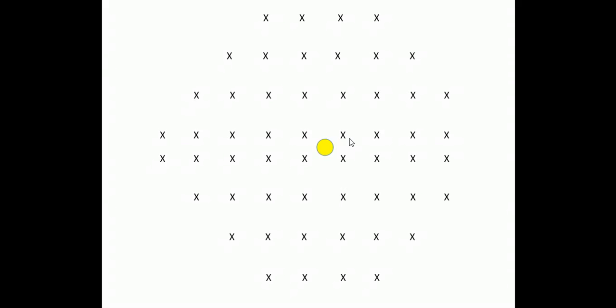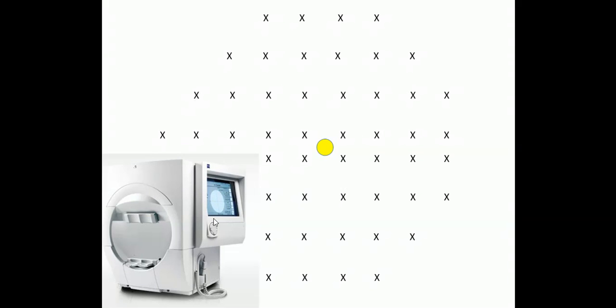So the machine is built in a clever way. First of all, there's a screen over here, and we can't see it here, but this light has a camera associated with it that's taking a picture of the patient's eye. The technician running the test can actually see the eye. It's a live video, and if the patient's looking around, the technician can see that the patient's eye is moving around, and will obviously encourage the patient to look straight ahead. But the machine does something even more clever. The machine actually tracks the amounts of eye movements of the patient.